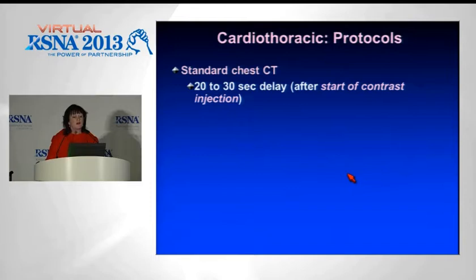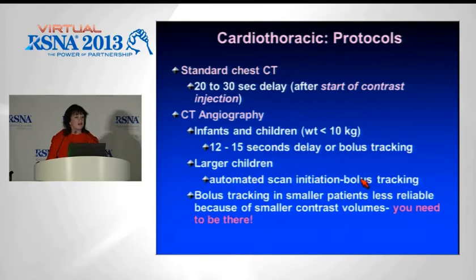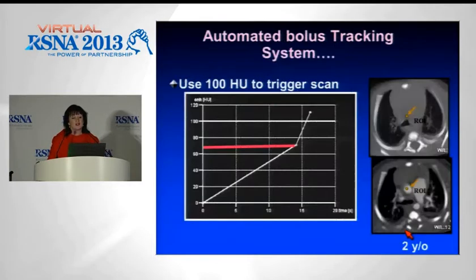So in our department, we'd actually start scanning about 30 seconds after the injection has started via a pump at a relatively fast rate. However, in tiny children, and in children who are complex and difficult and have abnormal anatomy, really you should be in the console room with the techs, not in the scanner itself, looking at the images and acquiring them at a time when you know you have contrast in the structures you need to see.